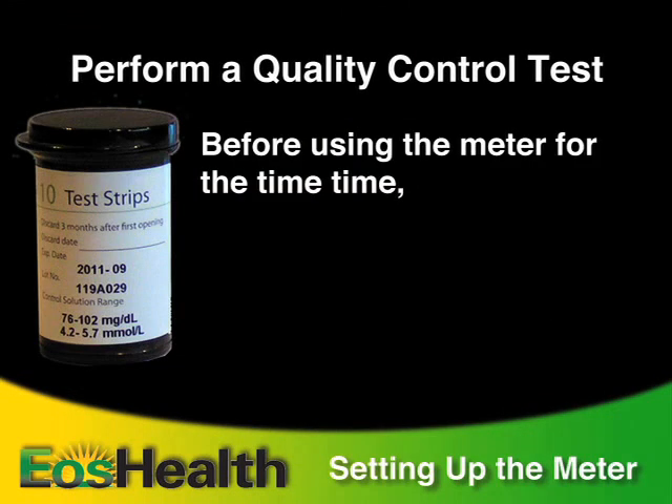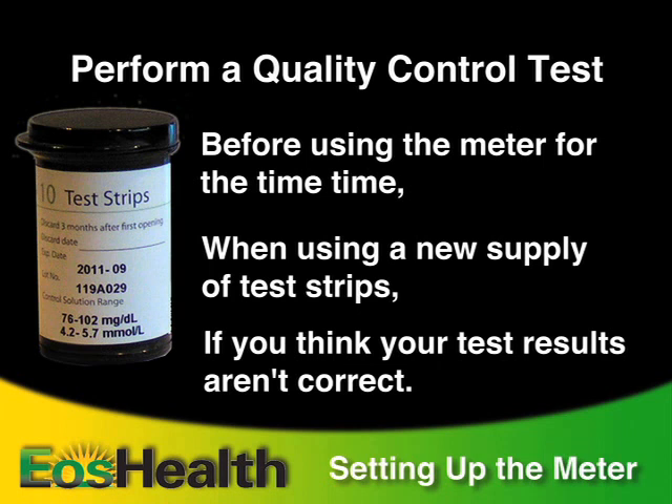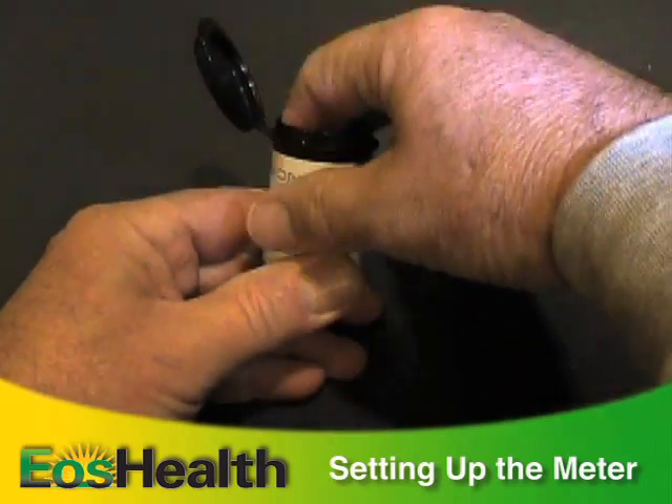To make sure your readings are accurate, you should perform the quality control test before using the meter for the first time, when using a new supply of test strips, or if you think your test results aren't correct. Here's how to do the quality control test.